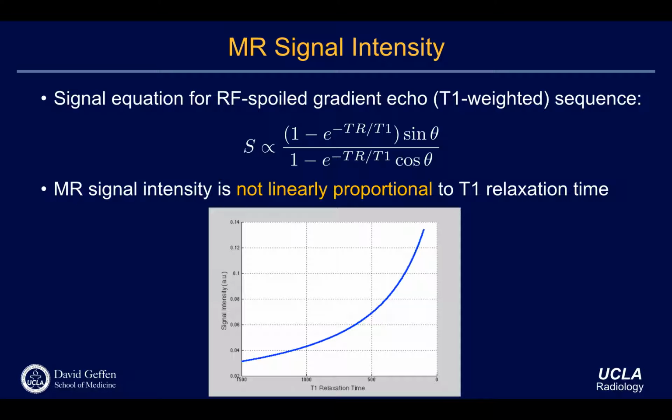because we use the contrast agent, alright? And it means we use some paramagnetic molecules. It means we have B1 inhomogeneity. It means our flip angle is changed. Okay, so you are right. We apply 50 degrees, but how about the tissue? What does the tissue see? So it's two separate questions. If you choose 50 degrees, your sequence will run 50 degrees. But whether the tissue will behave as 50 degrees is a separate question. Sure, there is a B1 variation. I don't think the contrast agent will increase the B1 variation. It is more a tissue conductivity issue.